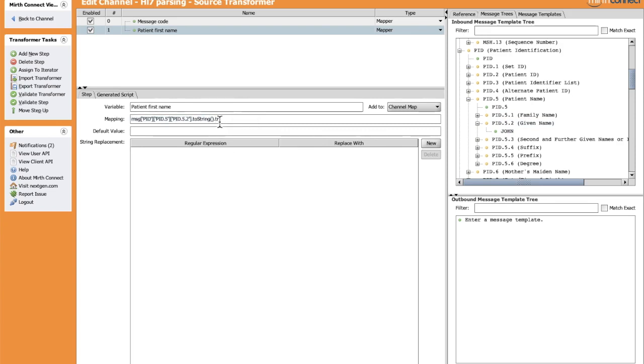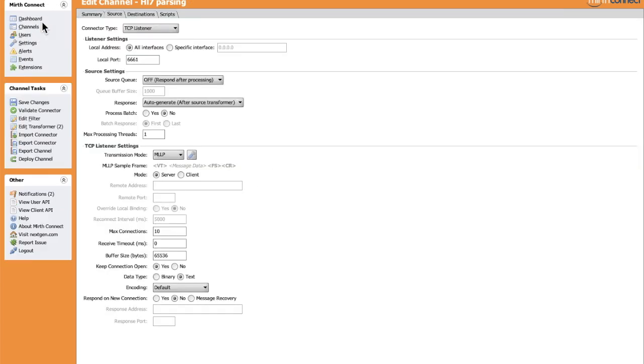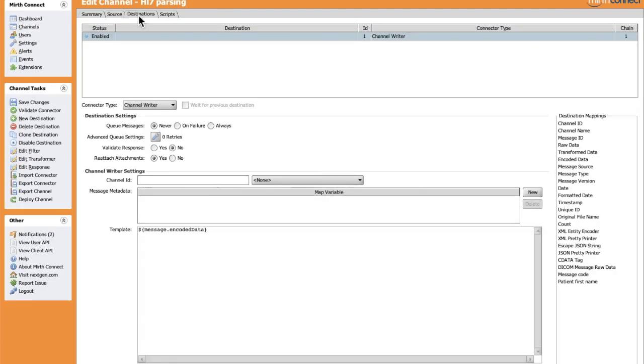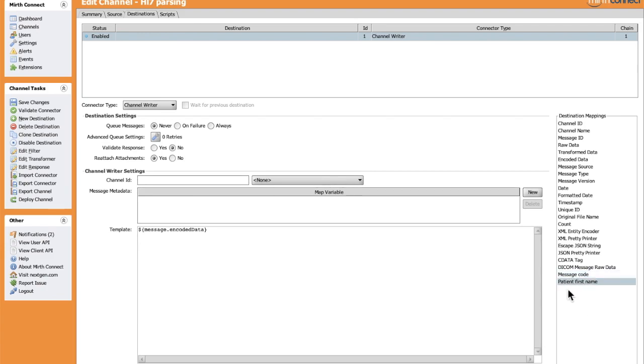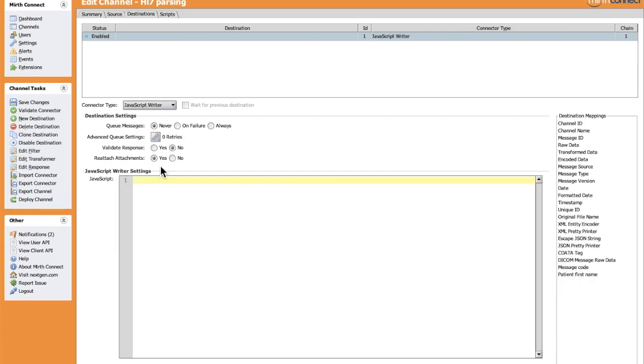After finishing the parsing in the Edit Transformer in the source section, let's go to the destination. As you see here, we have the two values: Message Code and Patient First Name. We can use these two values by drag and drop them in the body of the destination. For example, let's log them in the console. Let's choose JavaScript writer to write some JavaScript code. Let's log these two values in the console using the info function of the logger class.